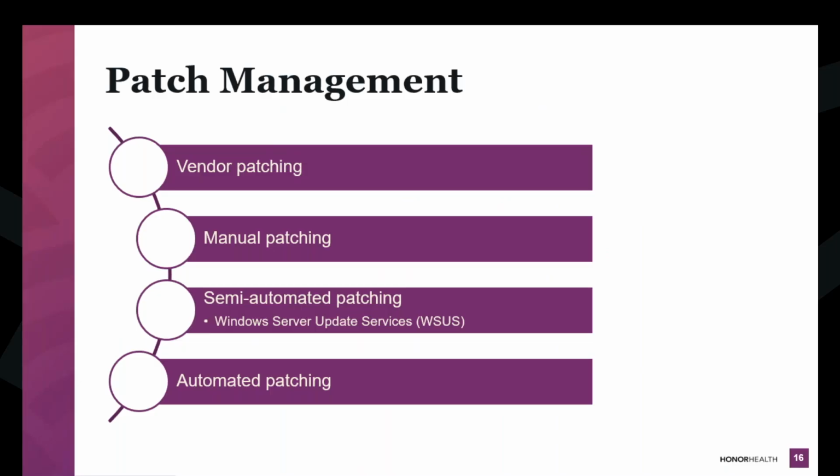And then the next time one of our vulnerability or patch management specialists goes to that device, they just hit the check for updates button, and everything that's approved can now install on the device. So it really makes it easier from a biomed perspective, because you're not in front of the device trying to figure out what do I need to install to secure this device. It's going to be done on the server side, and it makes it a lot easier. The last option, automated patching. Sounds awesome, right? Automated, someone's going to do it all for us, but automated patching means IT is going to do it for us.